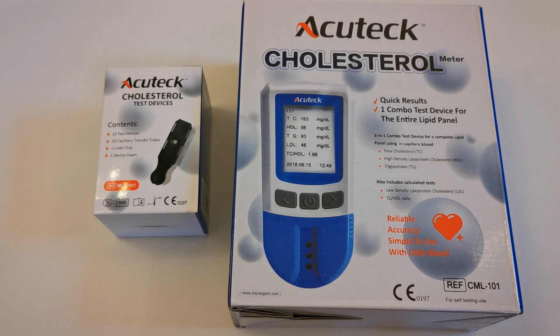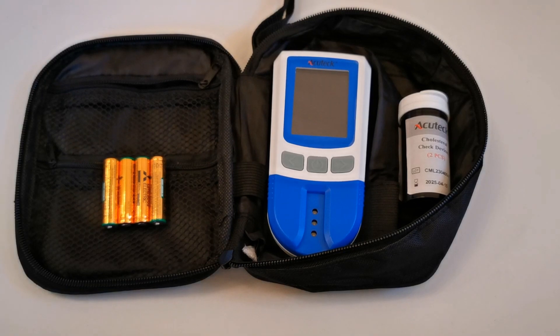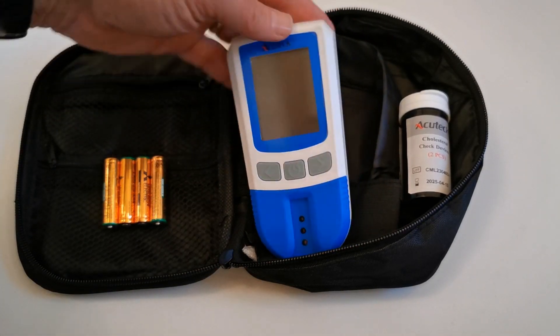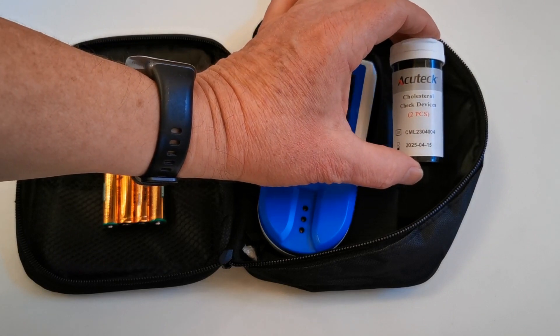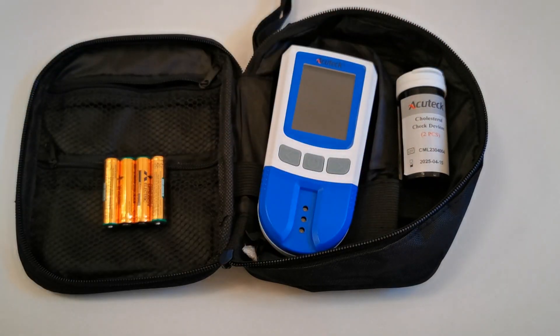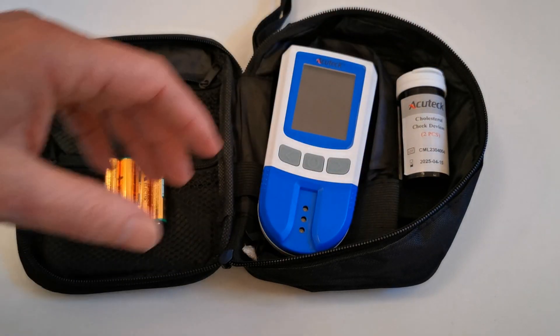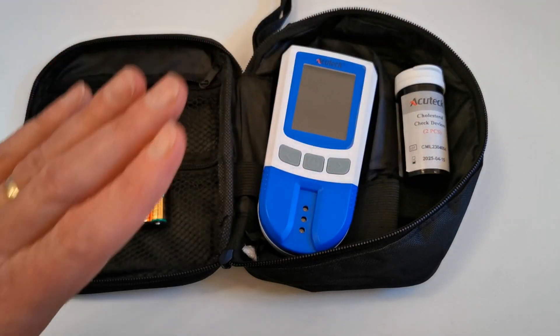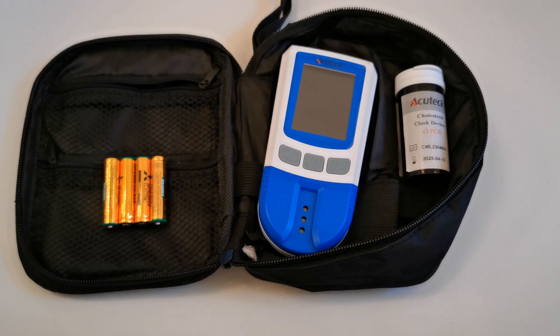Let's crack open one of these boxes and show you what is received and how to set up the meter. The meter box contents includes the digital handheld meter, which is this device here. Also included are two control check devices, which can be used for checking the optical function of the meter at any time. They have a two-year expiry and they can be used multiple times.